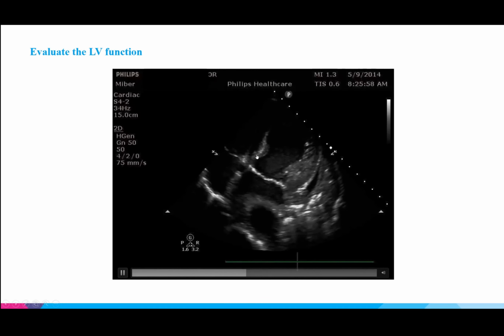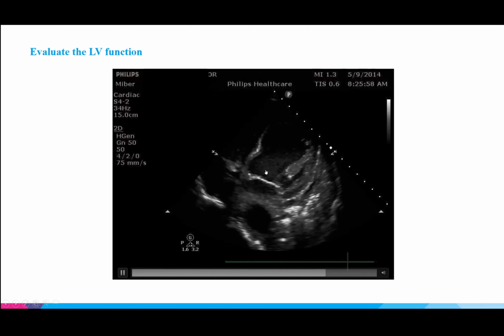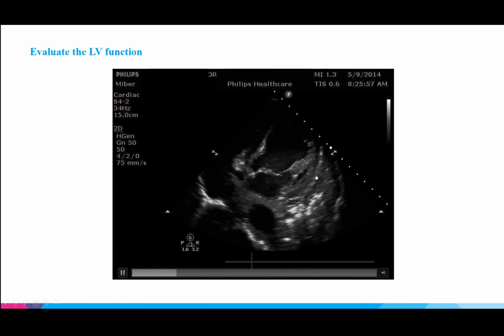So I would say there's some movement as we get closer to the mitral valve. You can see some movement here and here, but the cavity itself really doesn't change much. It stays pretty much the same. So this is actually a patient who had a severely reduced EF. As we get more practice, you'll get more of the hang of it, and you can compare it to someone who might just have a mildly reduced LV function. Any questions about this? This patient actually does have a little bit of a pericardial effusion here, you can see.